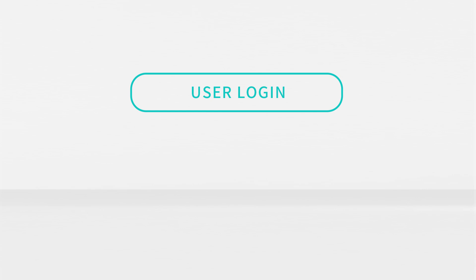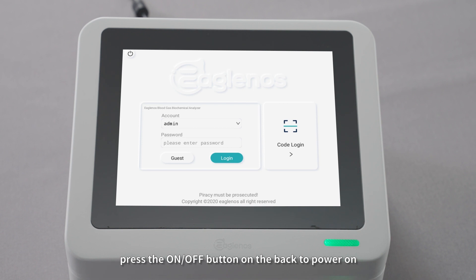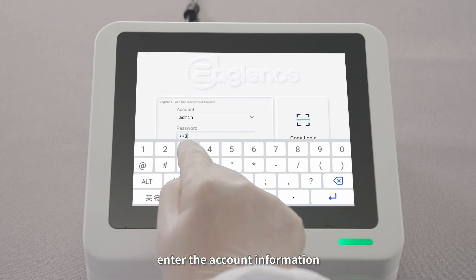Step 1: User Login. Press the ON-OFF button on the back to power on. Enter the account information.